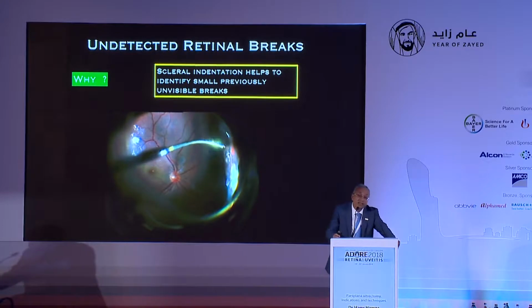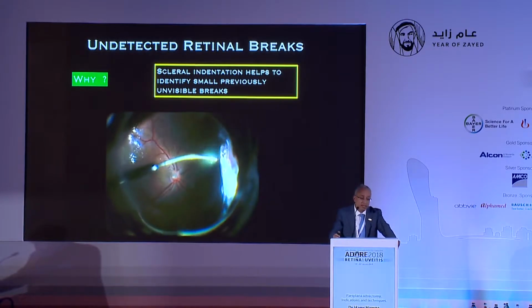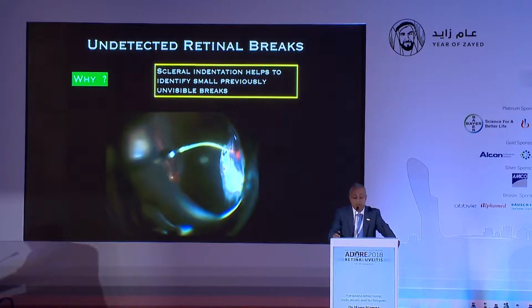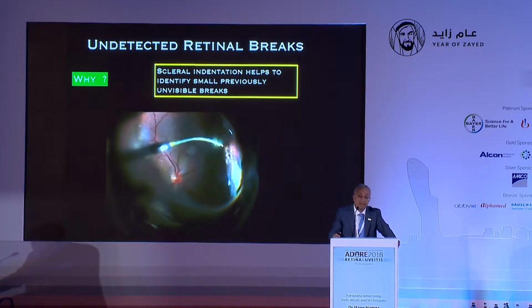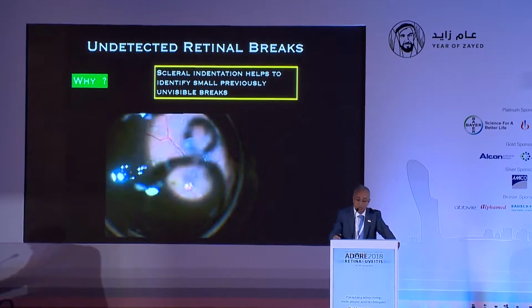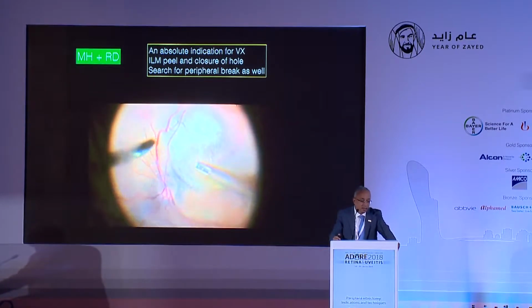Undetected retinal breaks is another indication for vitrectomy, simply because using scleral indentation and the modern visualization techniques, you can detect retinal breaks that are not visible by the indirect ophthalmoscope, as in this case.